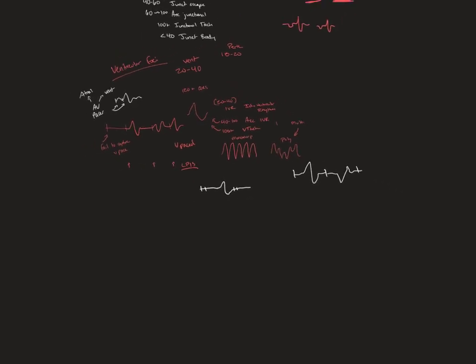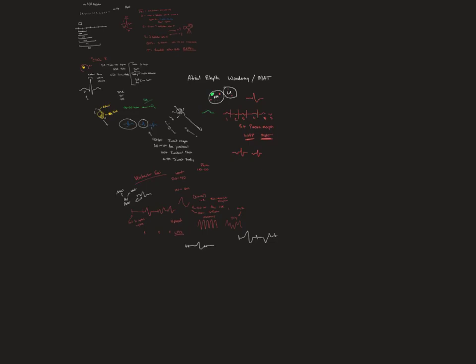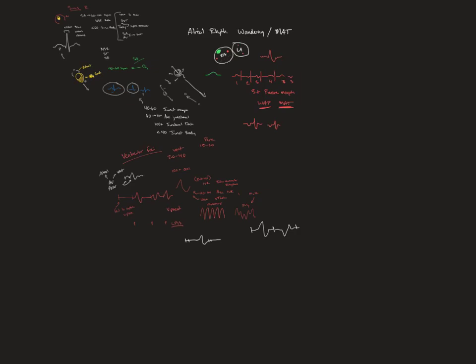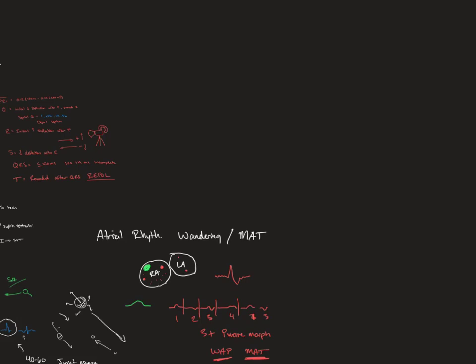I know I personify this stuff, it's silly, but this is all the stuff we've done so far. Wow, it's really not that much. I'll probably keep these to an hour, so I have 10 minutes left for this lesson. We've gone over sinus, atrial, junctional, and ventricular. Let's first define what an escape beat and an escape rhythm are.